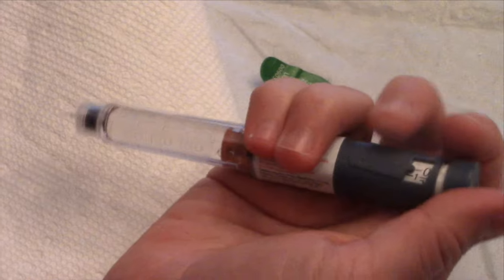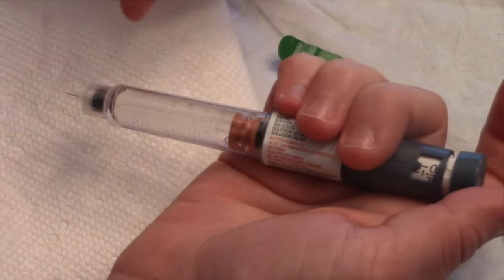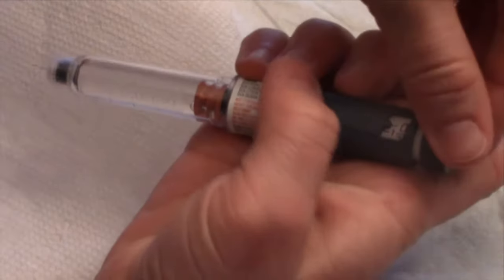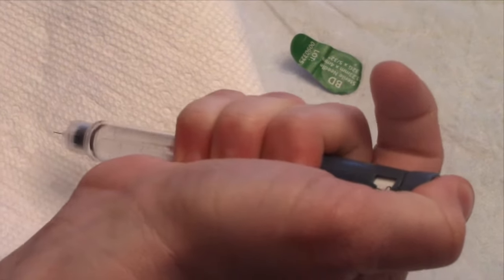When priming the needle, if you have dialed it to two and you realize there's still no insulin coming out through the needle, you're going to want to do the process over again. Turn back to two units and try again. Repeat this until you see insulin coming through the needle.